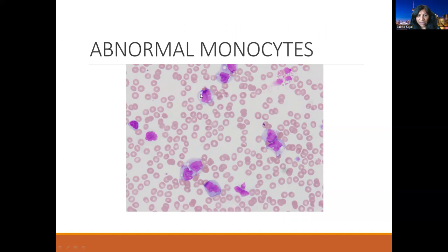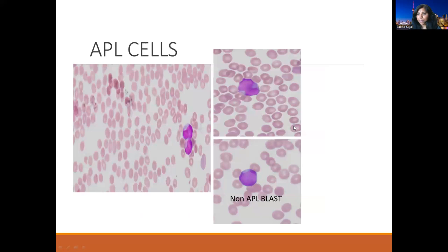These are abnormal monocytes. First of all, there is monocytosis. All those monocytes are big and large with pale-looking nuclei. We also have multiple vacuoles within those cytoplasms, and a few of the nuclei are showing prominent nucleoli. These are abnormal-looking monocytes which need further investigation.